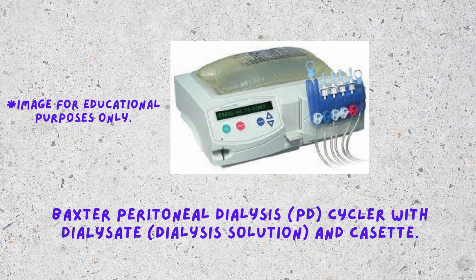And this is usually done by the patient at home. So I included a photo of what a standard peritoneal dialysis machine would look like. This can be different from company to company. The one I added in the photo is from Baxter, which is a medical company that provides the machine, monthly inventory, and medical supplies that make home peritoneal dialysis possible.